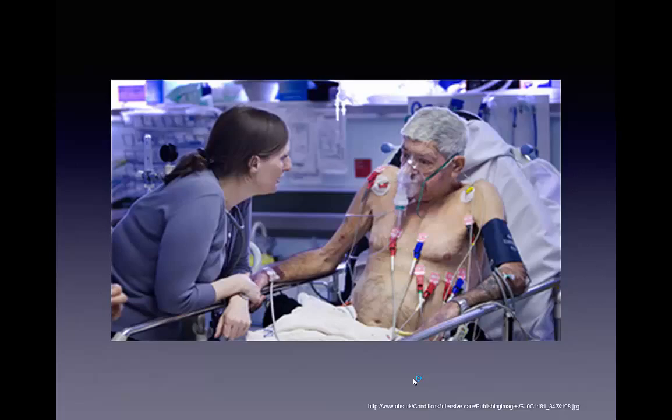For induction, we're going to use rapid sequence induction. He's going to receive a 50 microgram push of fentanyl after airway topicalization, followed by propofol, 20 milligrams, followed by rocuronium 100 milligrams. At this point, he will be laid flat, a few ventilated breaths will be delivered, and then we will proceed with laryngoscopy.